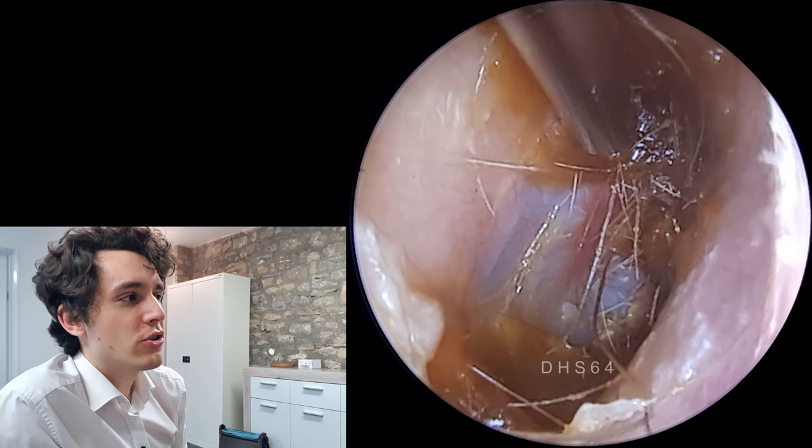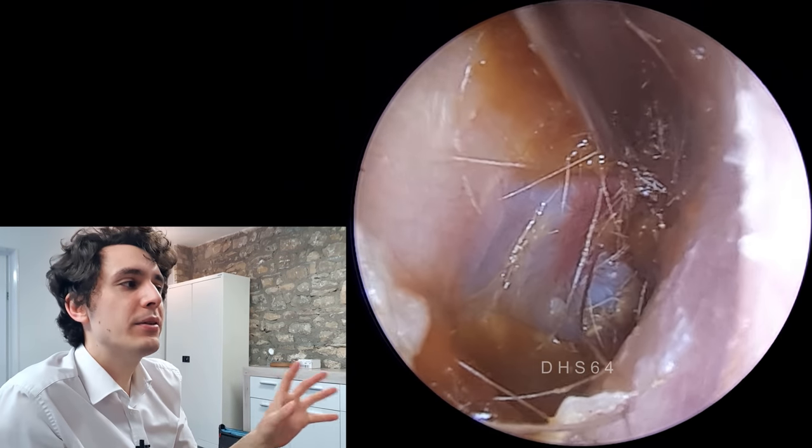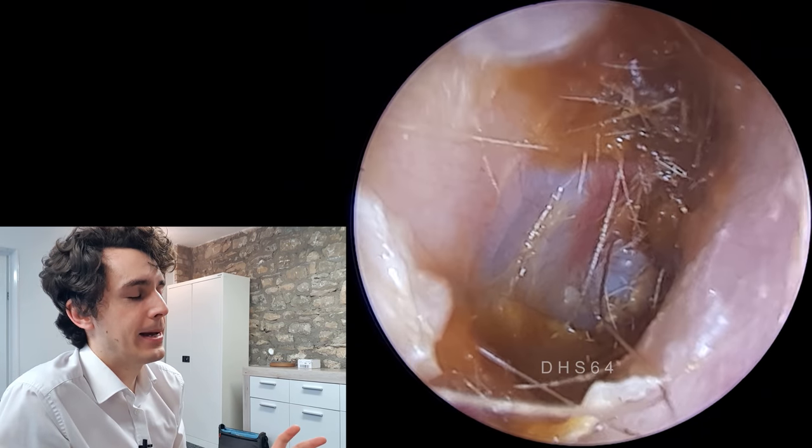You can see we're getting a little bit shaky here — the patient is getting a little bit jittery. So another round of irrigation just because the patient was starting to get a little bit jittery there. As you can see, I'm pulling the trigger and that's making the water go.